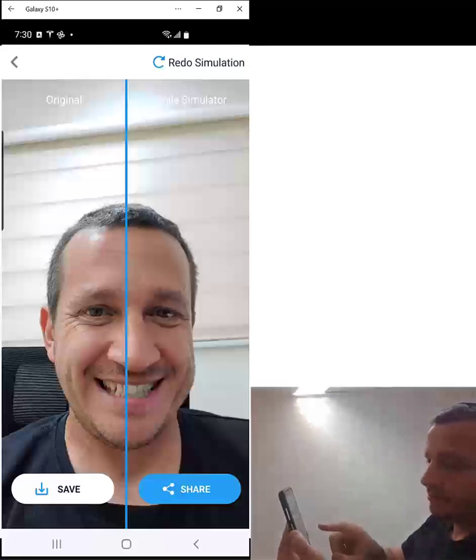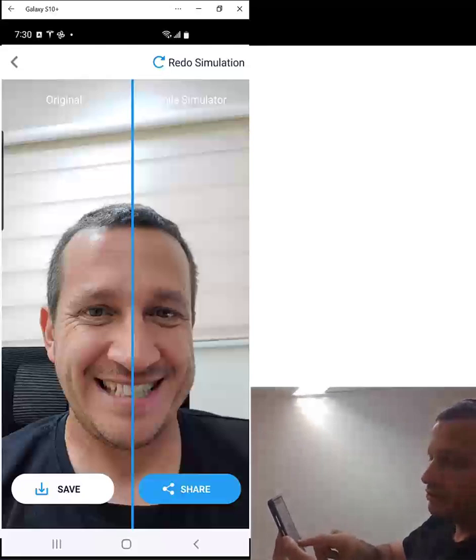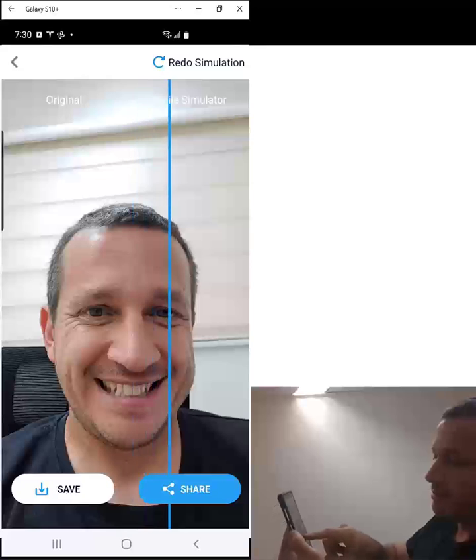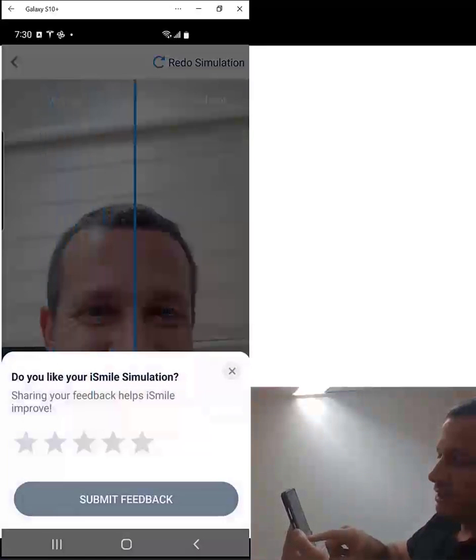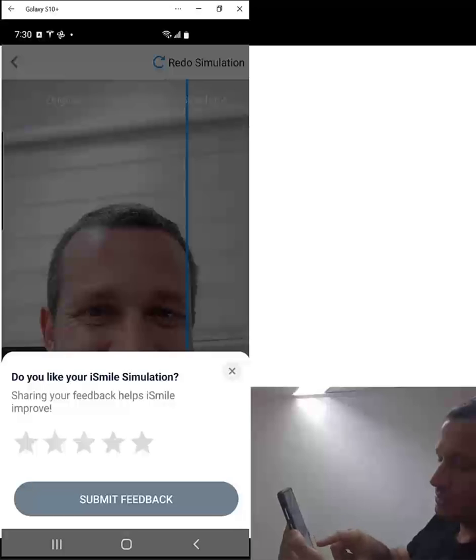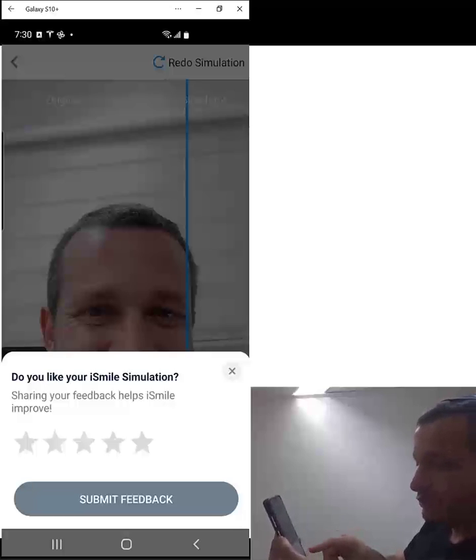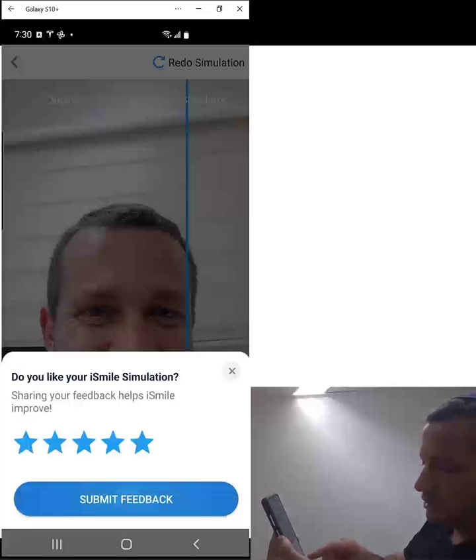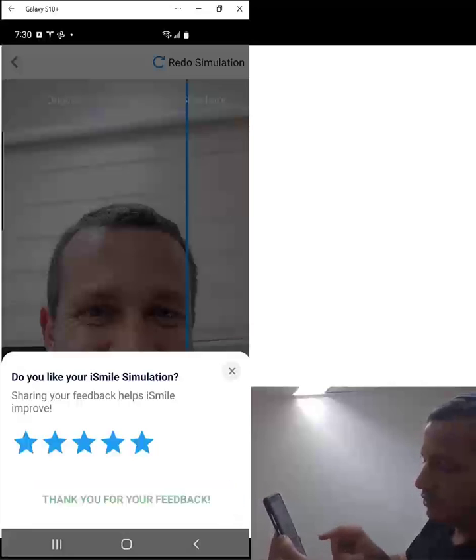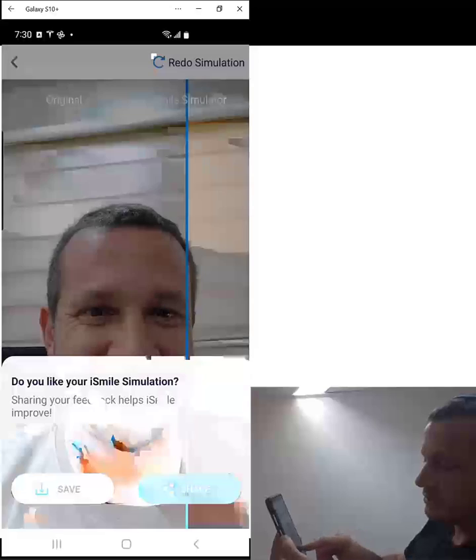The right side of the screen is the iSmile simulator. Simply tap on the screen, grab the blue line and drag it from side to side. Up here, we're prompted to rate the simulation — this is important as it helps us improve. So if you like the simulation that you received, give us a five-star rating and click submit feedback. Then you can go ahead and close this.